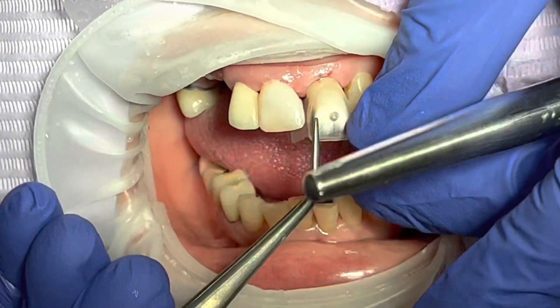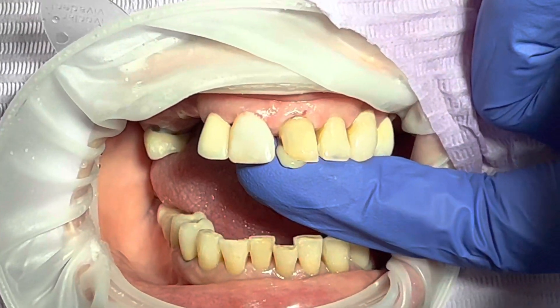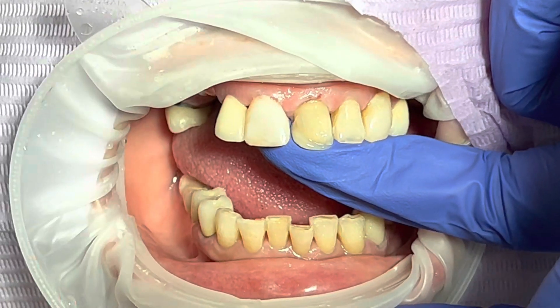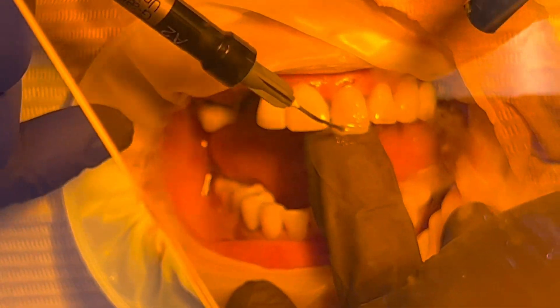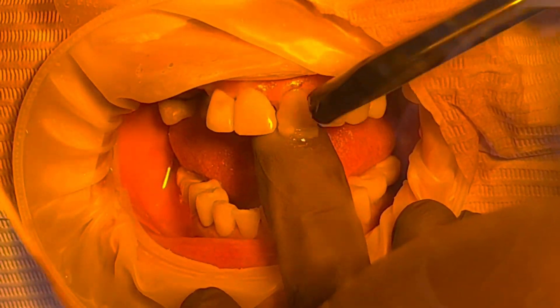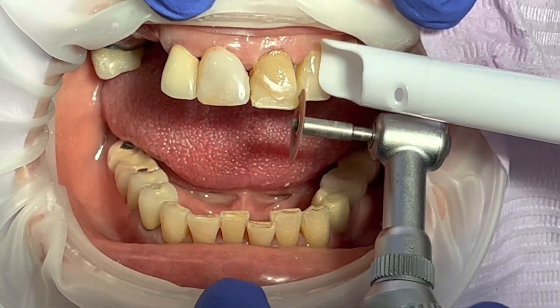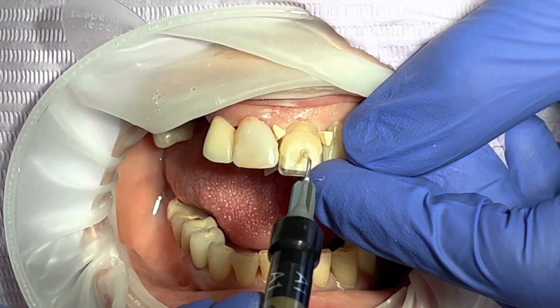Now I have to etch really well. Before we do the composite, I want to make sure I try in the tray and confirm the template fits. I also have to do a couple of build-ups on the mesial aspect and possibly the incisal aspect to create a nice seal for the template to go in. Once we recreate the basic anatomy of the tooth — it's a very small tooth — we have to recreate somewhat the initial anatomy of the tooth, then I try the template in.